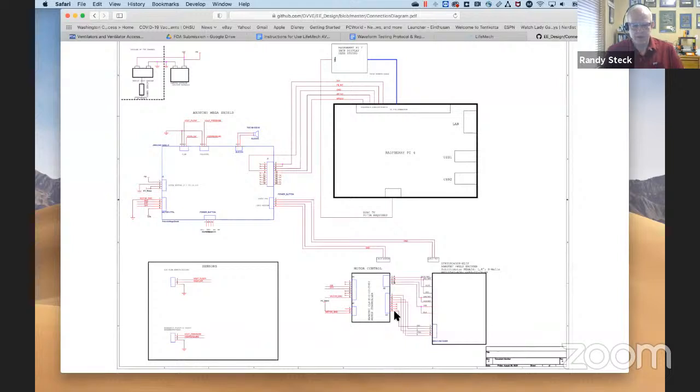We could probably back off of that requirement and use a less expensive stepper motor, but we built it into a closed loop system with an optical encoder on the shaft so that we could precisely control the position, velocity, and be assured that we'd never be missing steps or skipping steps, which was a real problem in the early running on this.